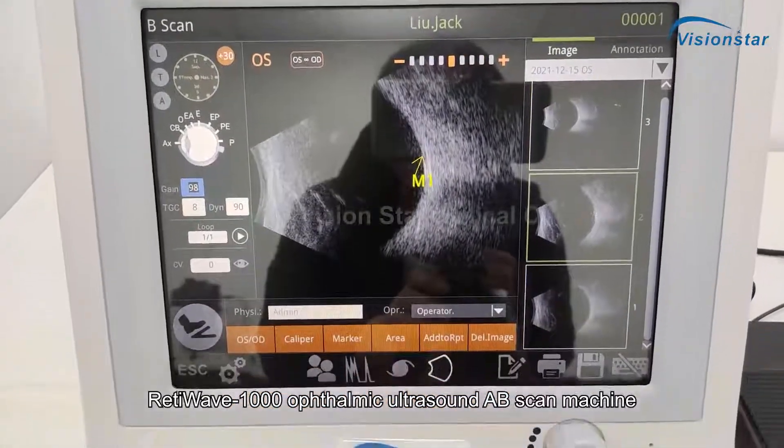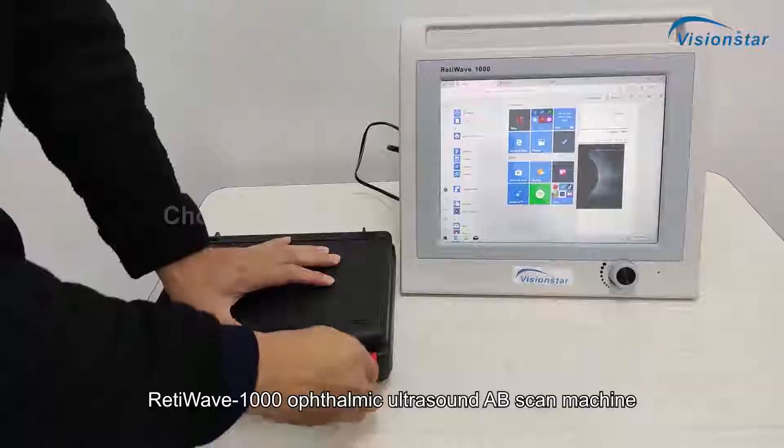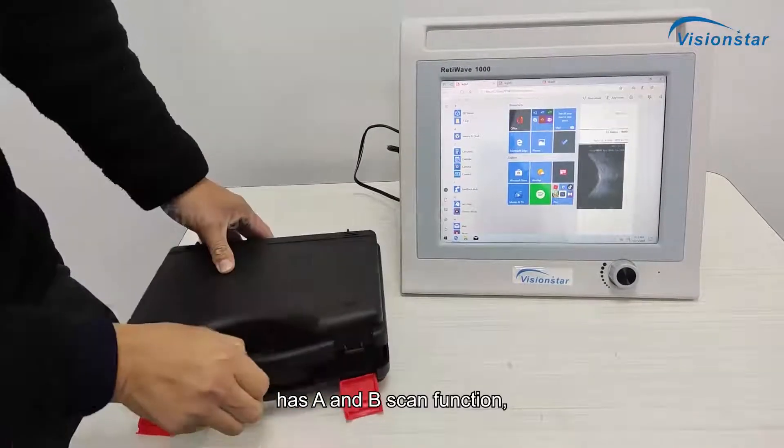RETIWAV-1000, Ophthalmic Ultrasound A-B Scan Machine, has A and B Scan Function.